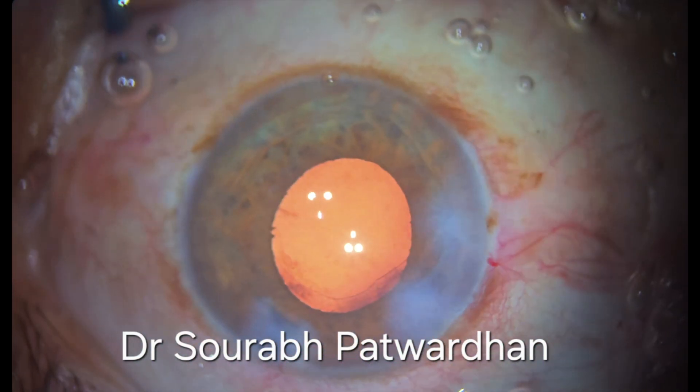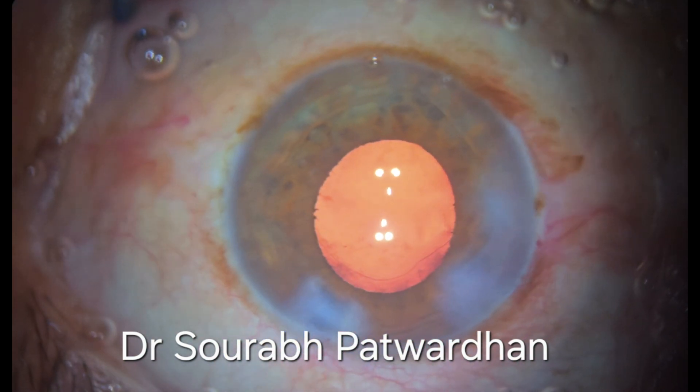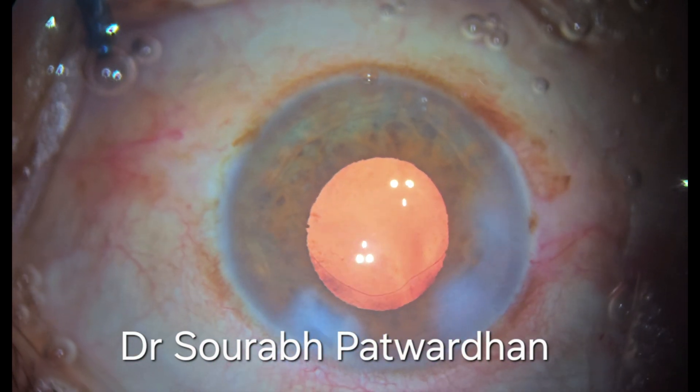So that's the end of the procedure. I have removed the B-hex and implanted the IOL. The eye looks quite good. So in these cases it's important to dilate the patient on table and use the pupil expansion device to deliver best results. Thank you.